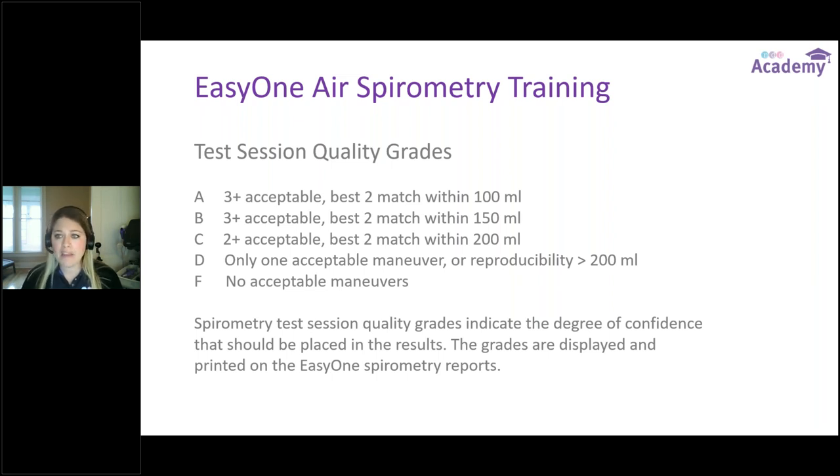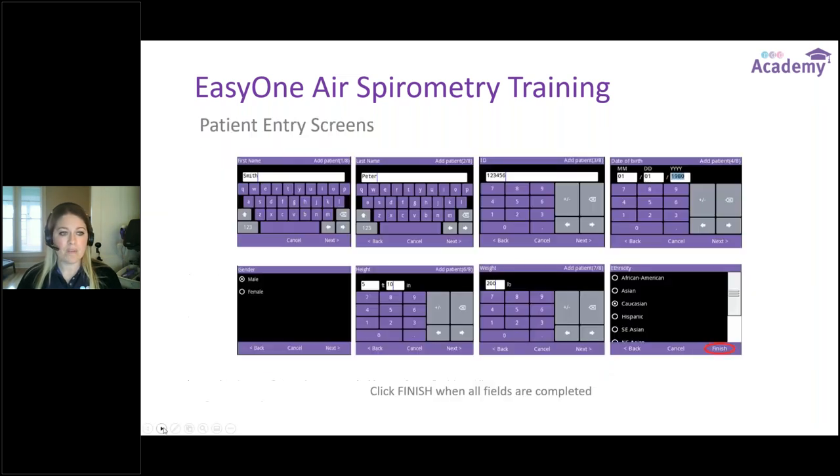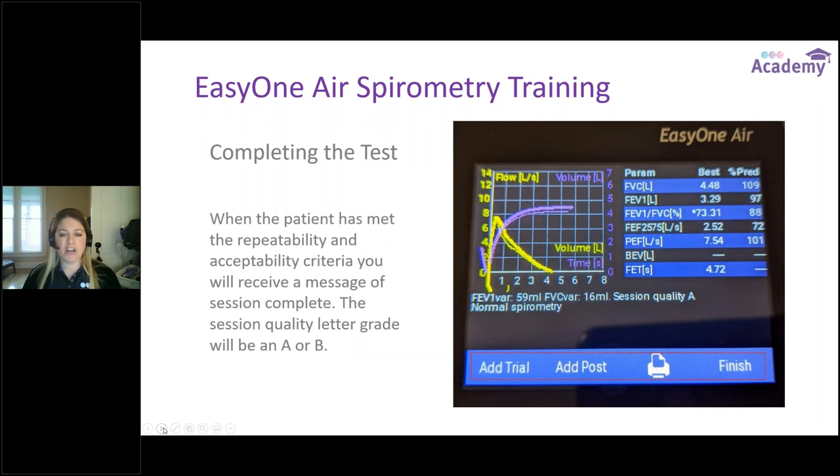This is a lot to remember — A through F — and each letter grade is pretty close to one another. If you'd like to access this after training, follow up with me and I can send it over. The key point is we want tests to be acceptable — meeting ATS criteria — and reproducible, meaning from one trial to the next they look almost identical. For an A, two of those trials must be within 100 mLs of one another. The quality grade shows up after Session Complete and after each effort on the EZ1 Air device results screen, and it prints on the reports.